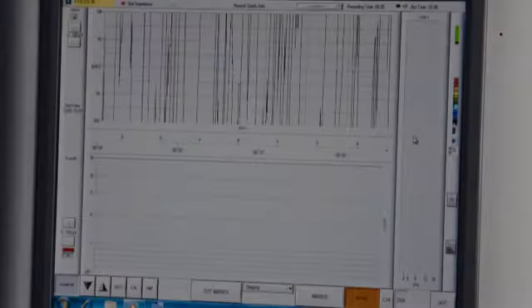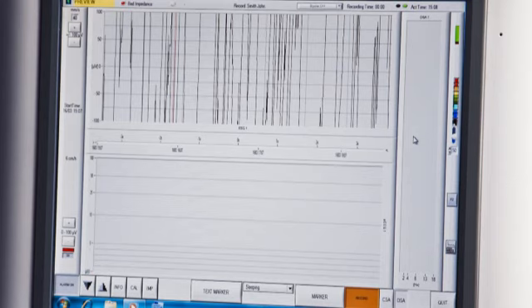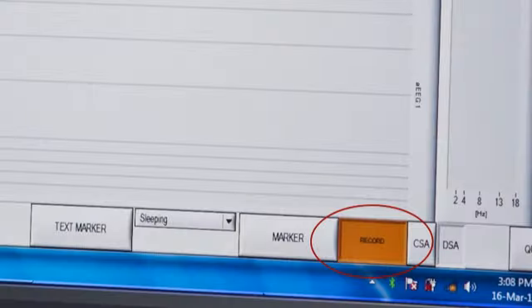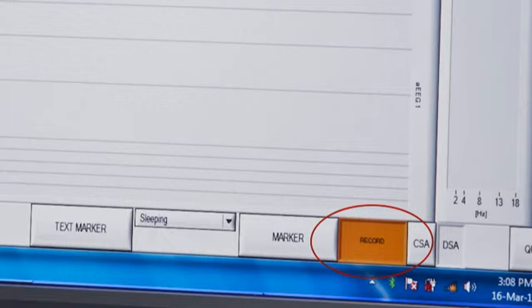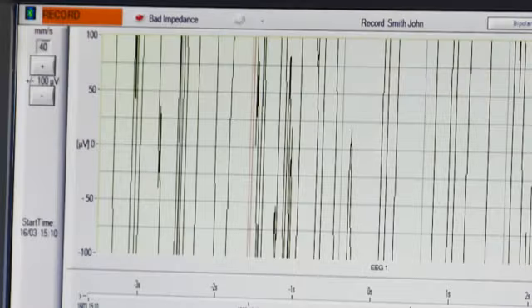Initially you will enter a preview mode. Here you can adjust the layout and carry out impedance checks to ensure the electrodes have good contact with the patient. When you are ready to record, click on the record button. You will then be recording data.